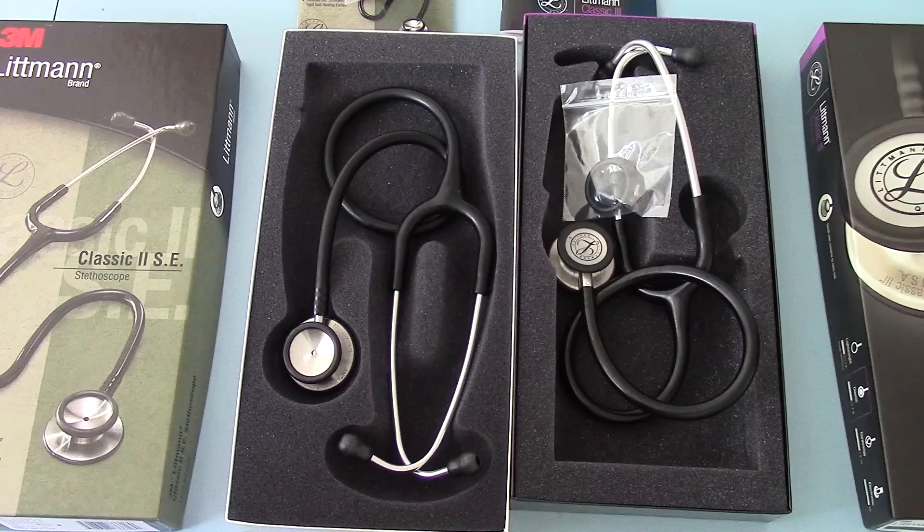In terms of recommendations: if you can afford it, because it is more expensive, the Classic III is certainly the way forward. If you still want the benchmark Classic II SE, there's nothing wrong with it — it's a perfectly good and very good quality doctor's stethoscope. Both units are available for purchase from our ValueMed website.